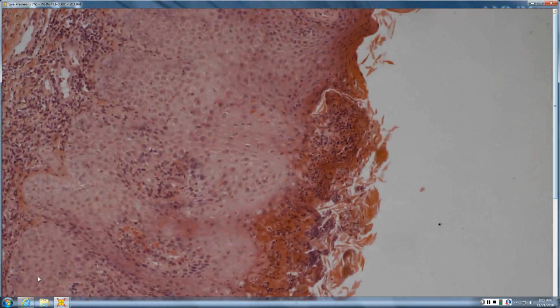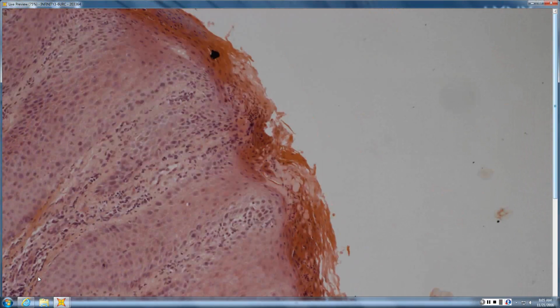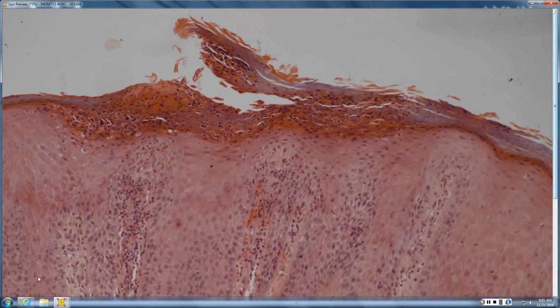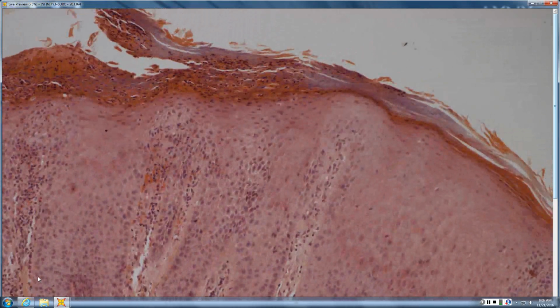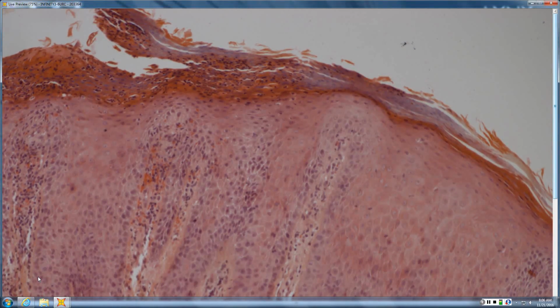There's definitely some acanthosis, mostly irregular, and then there's neutrophils in the horn and parakeratosis. So psoriasis, I'm thinking, and then I thought there was a little bit of extravasated red cells. I thought about pityriasis rosea too. Extravasated red cells certainly can go with PR. Neutrophils in the horn go with psoriasis. What's your full differential for neutrophils in the horn? P-tick: psoriasis, tinea, impetigo, Candida, subcorneal pustular dermatosis, syphilis. So you sort of have to run down that whole list.